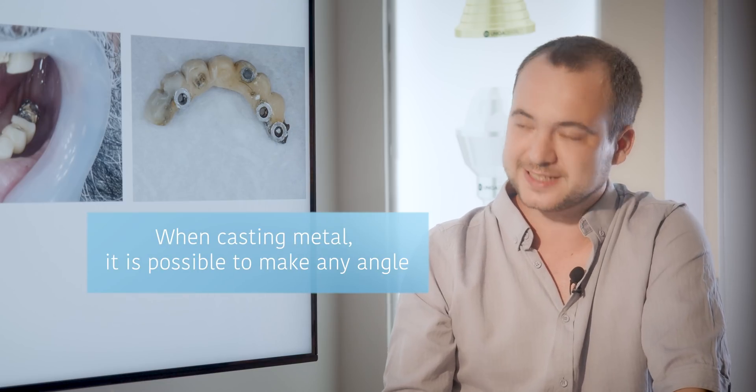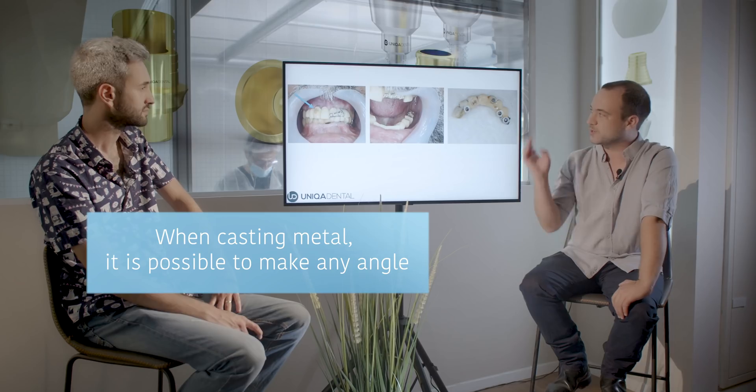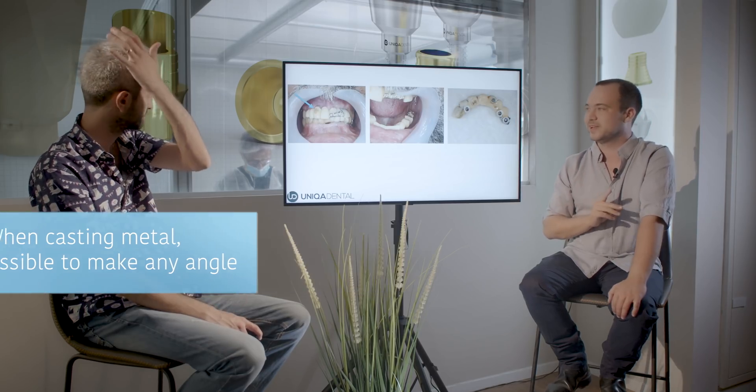You can see that we took off the bridges. The old ones were made from metal-based, probably with composite onto the metal and not porcelain. When you cast metal, you can do any angles you want — you can make a screw channel that goes like 40 degrees into the buccal with no problem. Now we want to change it to zirconia, which is a bit of a problem. We also didn't want any screw channel going into the buccal at all.